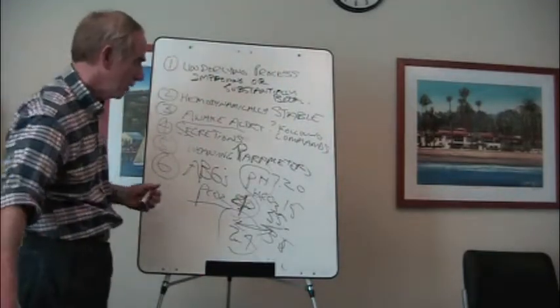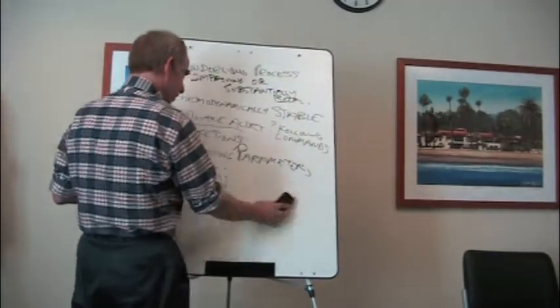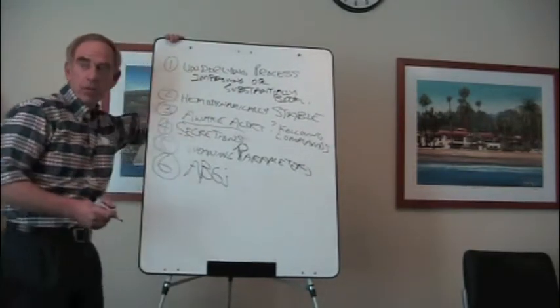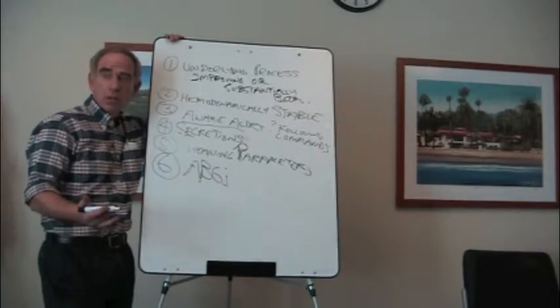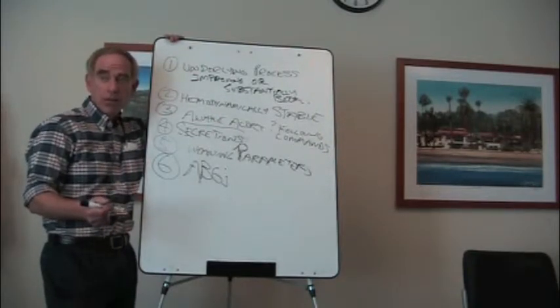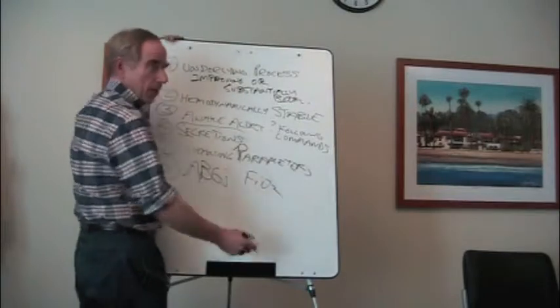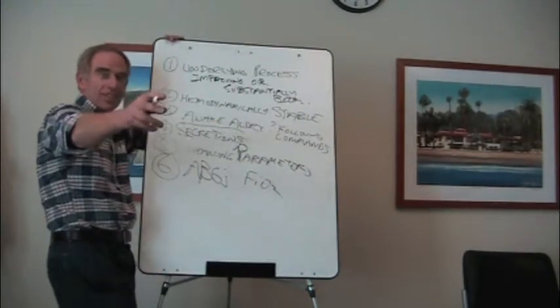Well, what's the minimum you'll be? What is the minimum acceptable level, let's put it that way. Obviously, you'd like it as high as possible, but what would be the minimal acceptable level that you would be willing to extubate somebody from? So it's 50%? Is that acceptable? No, I'd probably say 65. 65? FiO2. Oh, FiO2, sorry, I thought you were talking about an ABG. What's the minimum acceptable FiO2? 40%. 40, 45.